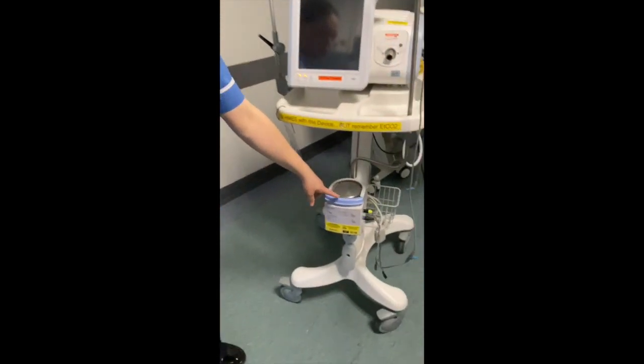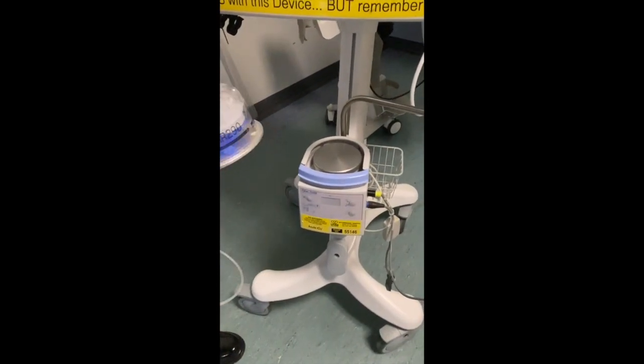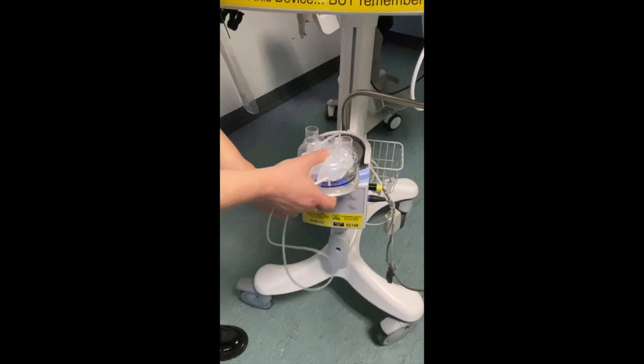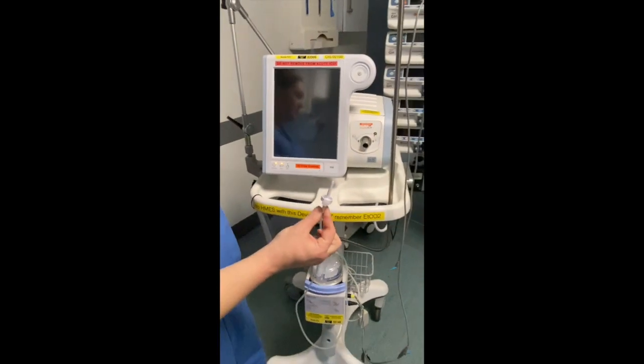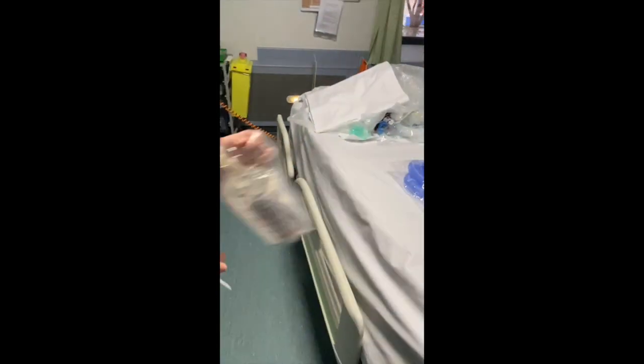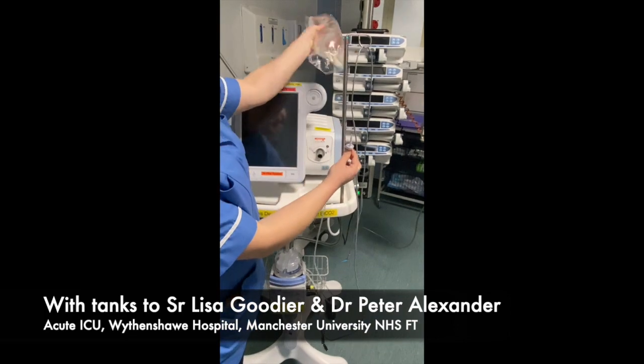On your ventilator, you have the humidifier. What you need to do is get your humidifier canister, push down the blue bar and it slides into place. You'll then need to plug the spike into some sterile water which hangs on here like so. I'm not going to plug it in because I'm going to waste it.